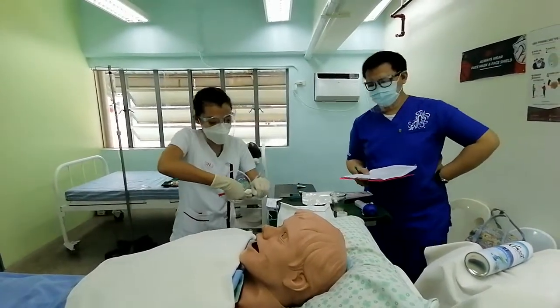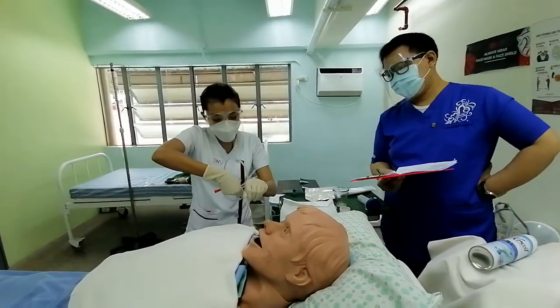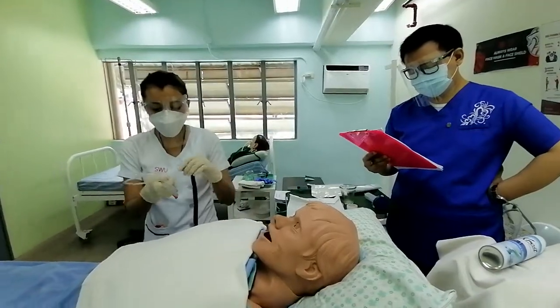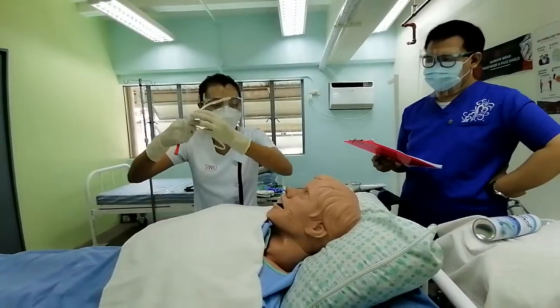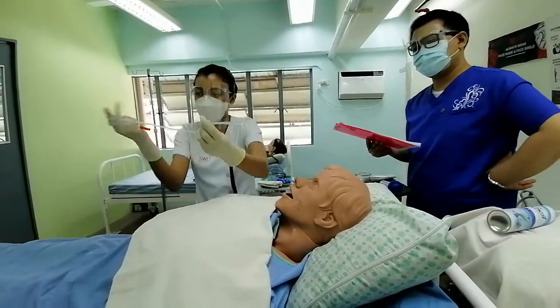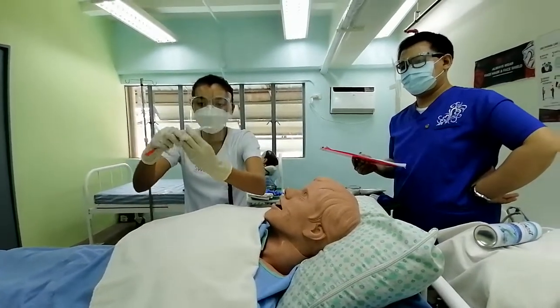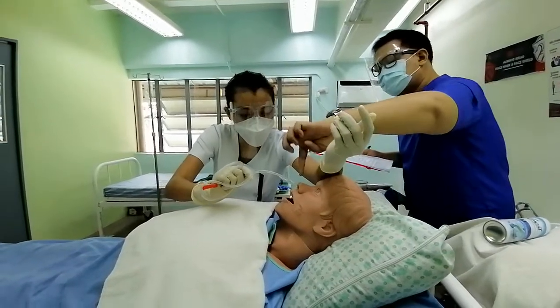And then encourage the patient to flex the head forward in order to access the nasopharynx. Sir, may you flex your head forward, and then gently insert the tube.